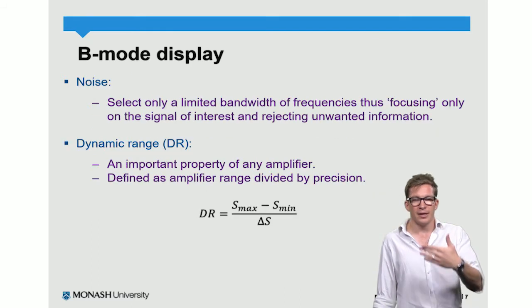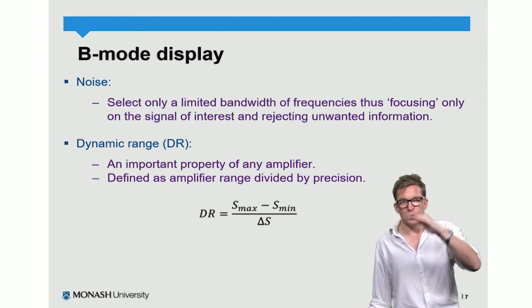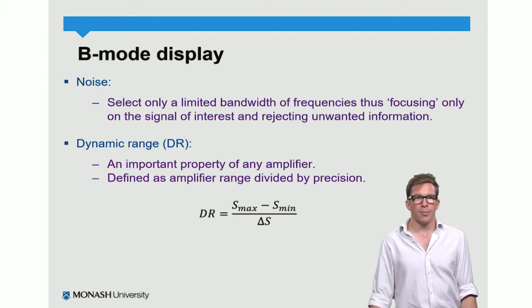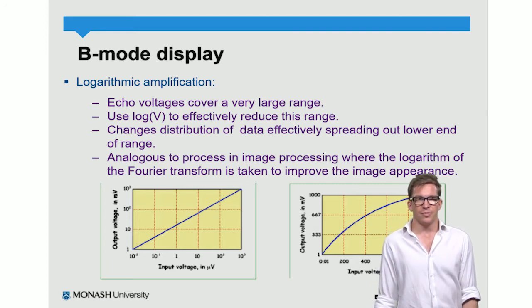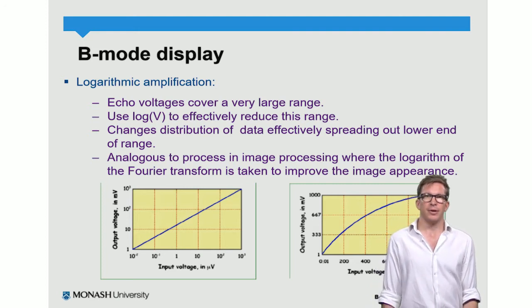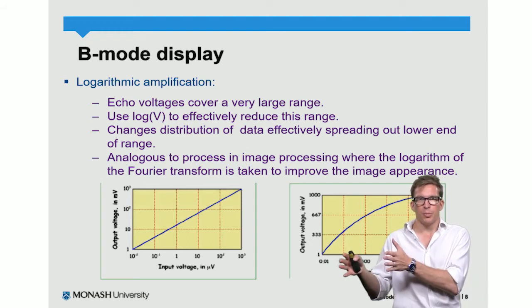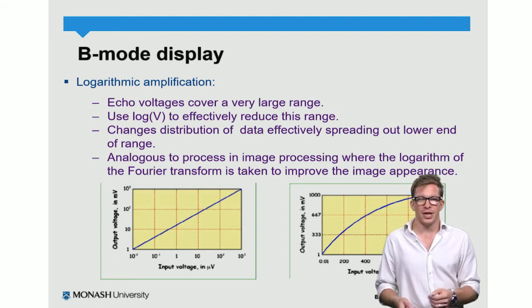So in the same way, just to confirm that we're applying that to voltages with respect to the treating of ultrasound pulses. One of the next steps of correction we have to do is a form of logarithmic amplification. Now in ultrasound, logarithmic amplification can be applied at multiple points, but the first one that we're going to discuss is called time gain compensation.